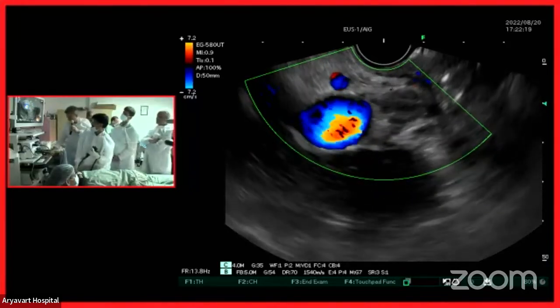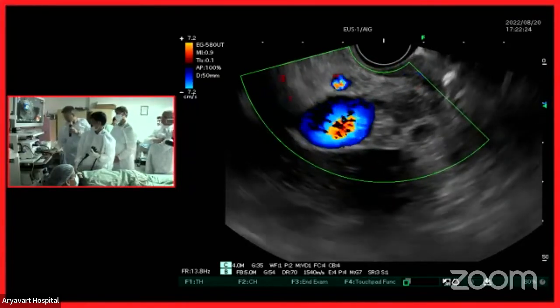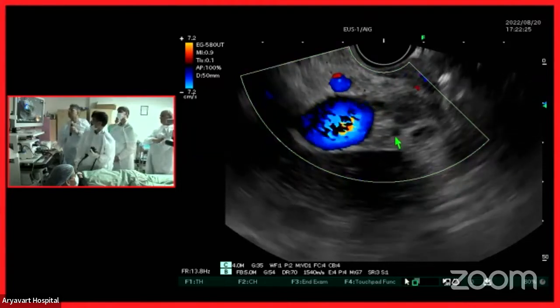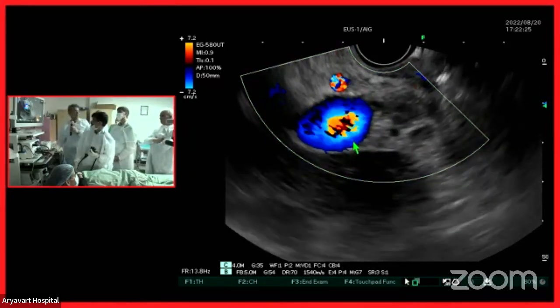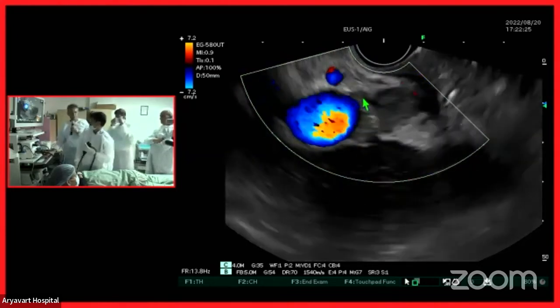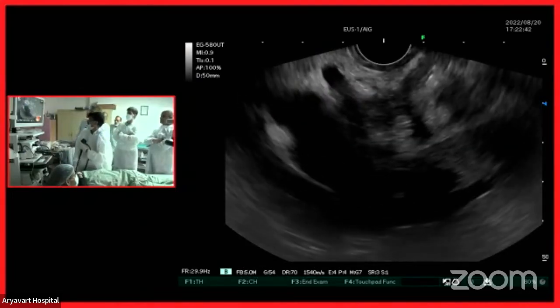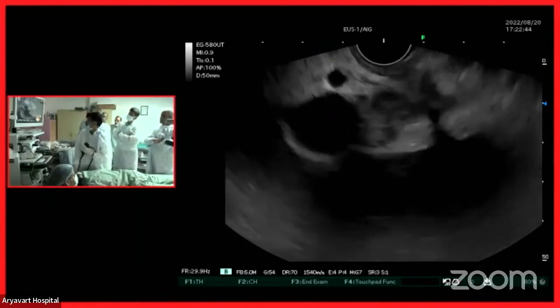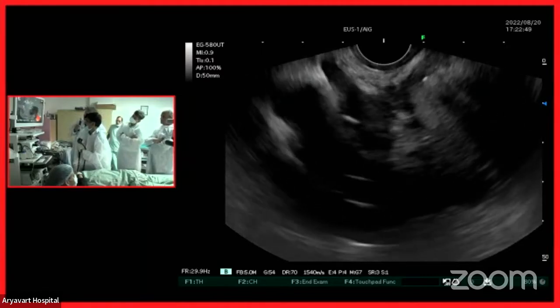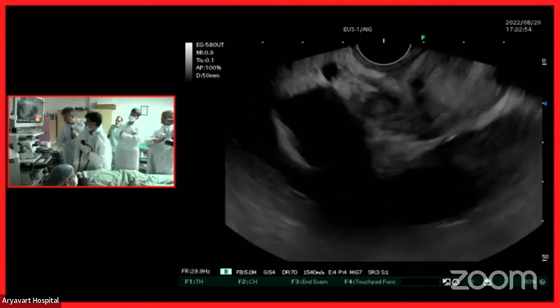If I would say that this is the arrow, that this is the 90-degree contact you are mentioning from here to here? Yes, I will make 90 degree from here to here contact. I agree. Fantastic. Because this is the tumor. Yeah, and I'm also looking for, I'm assuming, that's where I expect to find the gallbladder. So I'm looking to see if there are any coexistent stones within this tumor.